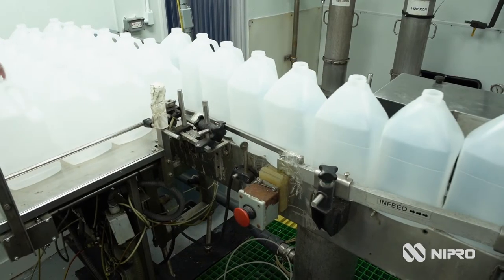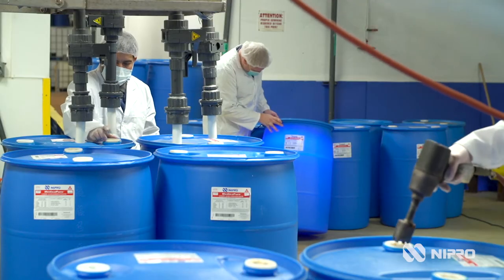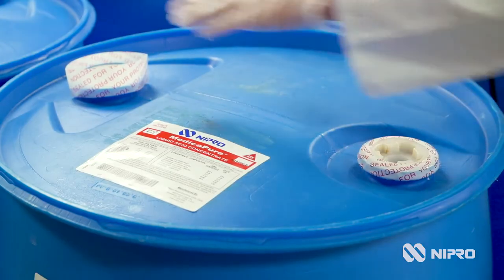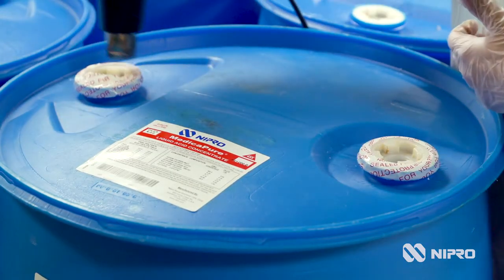In addition to one-gallon bottles, we also offer 55-gallon drums as a special order. These reusable drums are cleaned and inspected before being refilled and shipped.